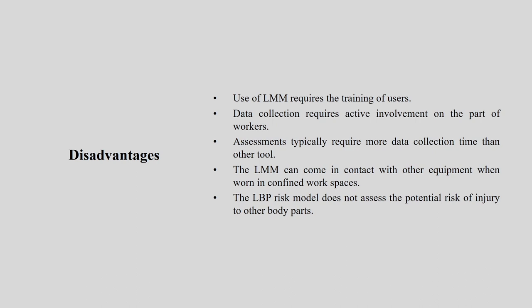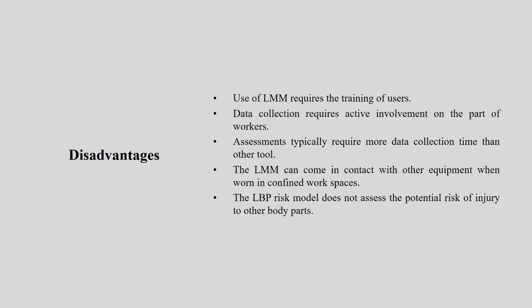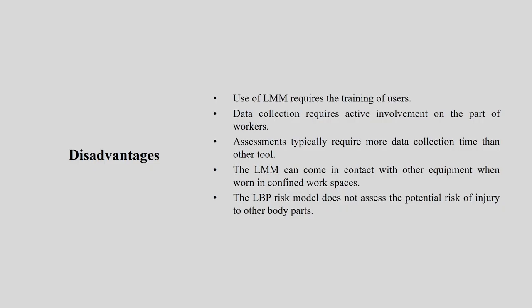Data collection requires active involvement on the part of the workers. If someone is not ready to accept that they will wear this exoskeleton and work, you will not get the data. So subject participation is very important. Assessment typically requires more data collection time than any other tool because you have a lot of setup, then the actual data and all those things. LMM can also come in contact with other equipment when worn in a confined workspace. So then maybe it is disturbing or problematic for the workers.